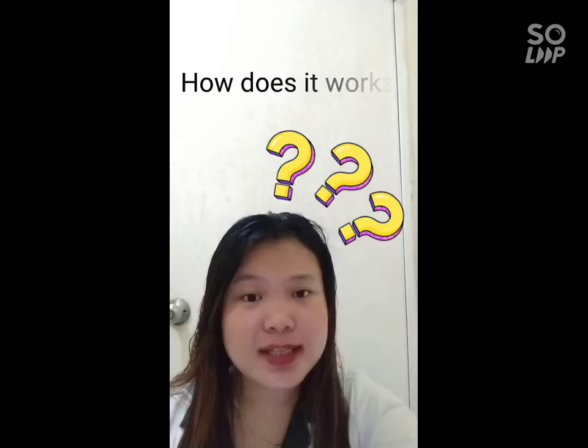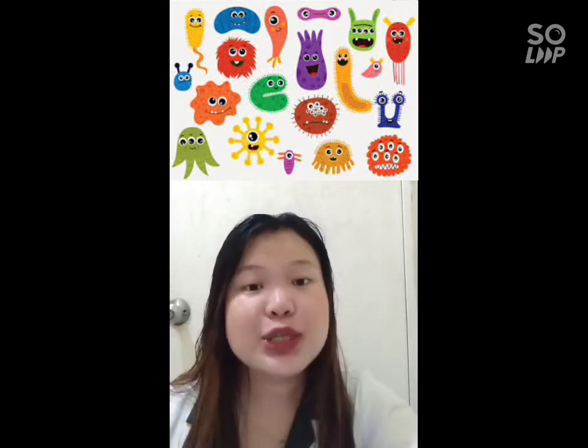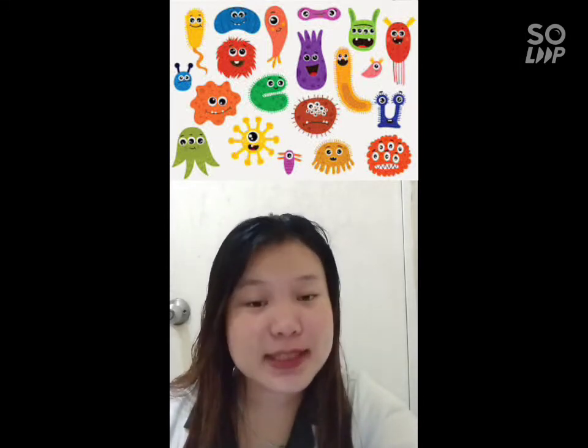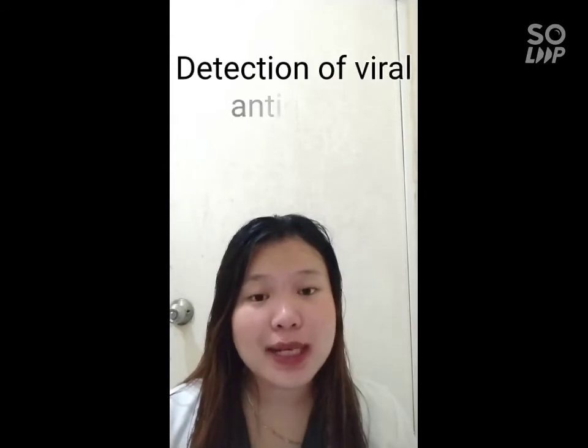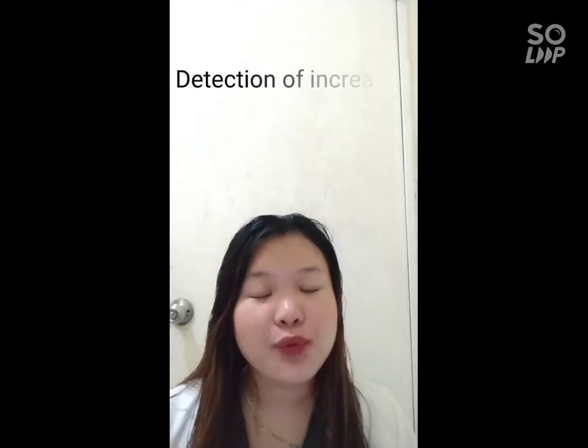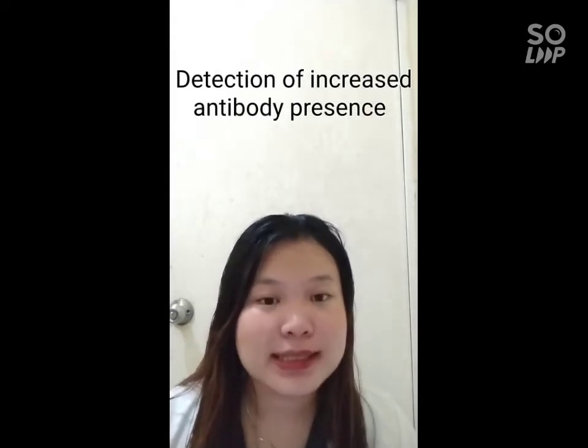The question is, how does molecular diagnostics in microbiology work? Every organism contains specific DNA sequences, so molecular diagnostics makes the specific DNA visible. It allows rapid detection by matching of nucleic acid sequences, by detection of viral antigens released during the infection process, or by the detection of increased antibody presence with specificity for viral proteins.